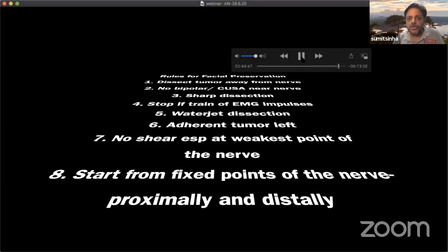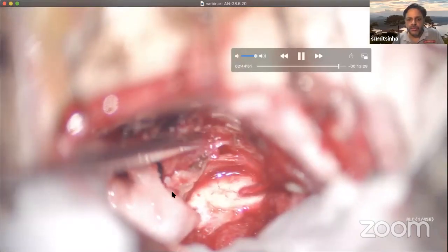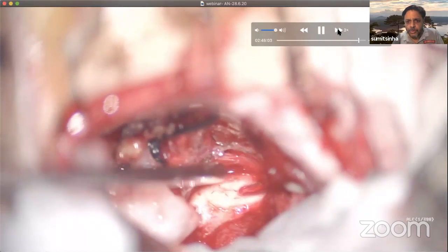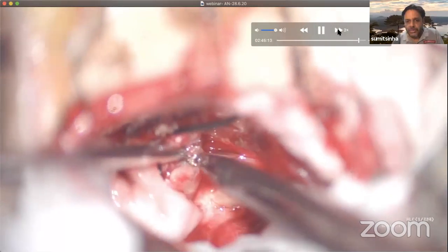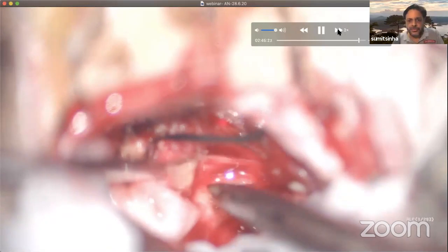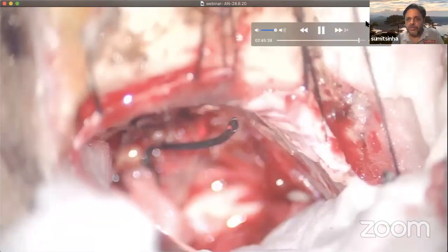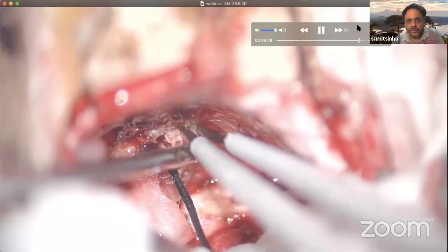So this is how you dissect the facial nerve, how you preserve the facial nerve. These are very, very important, valid points to consider during the entire surgical dissection. And this is how you can improve your surgical outcomes of facial nerve preservation after the surgery. And believe me, there is nothing more satisfying than to see your patient having a normal face, especially if she happens to be a young, beautiful lady. All might agree with me on this.